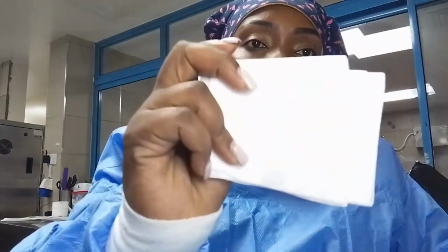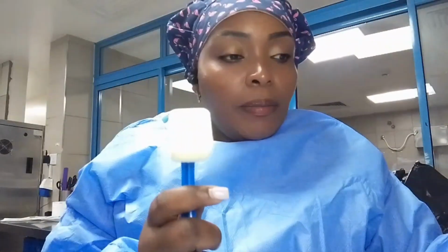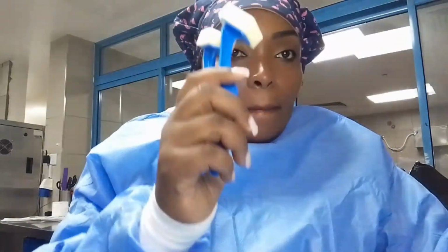So you have to suture that place. Then you have some gauzes, to wipe the site. Then you have this, which acts like a sponge holder, the sponge stick, to clean your area. You will soak this in the iodine solution, then you clean it. We have 3 in my kit.